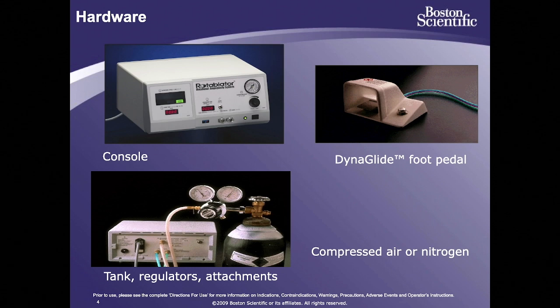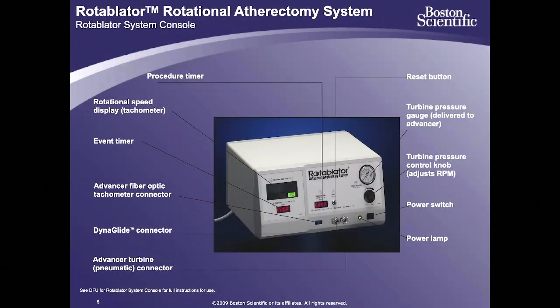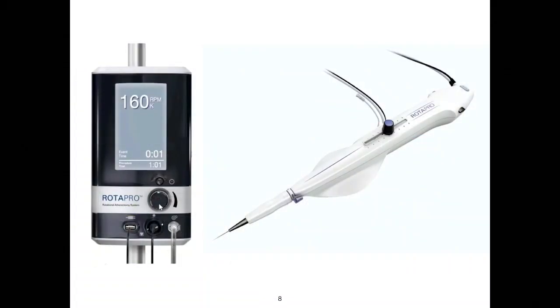So this is the rota system that we were all used to, and now what we have moved on to is what is known as the Rota Pro system, and this is the system that is now available. The advantage of the Rota Pro is that it is a single operator. You don't need two people to help you out with this, and it has made life easier.